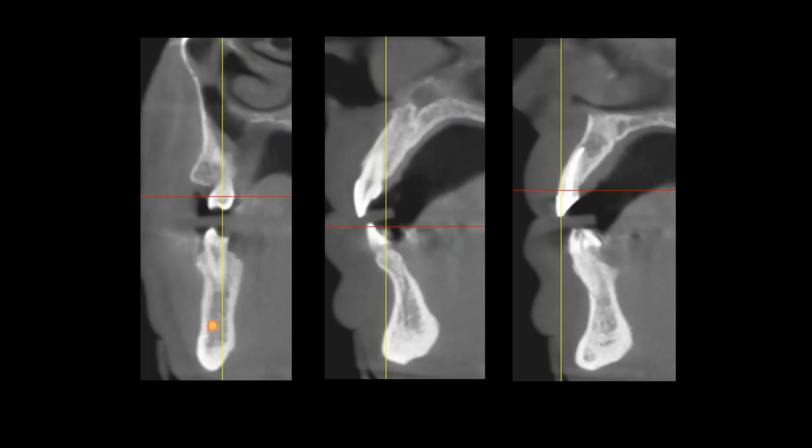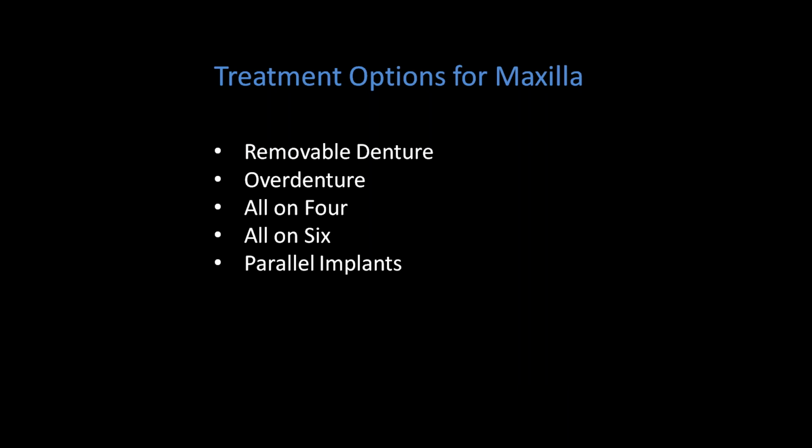And looking at the cross-sectional view from our CBCT, we can see, in fact, this was not an easy case. If we are to implement implant therapy, not only do we have radiolucencies, but we have some severe undercuts that are present in this patient's jaw. So our goal as dental providers was to educate our patient and to give him some options.